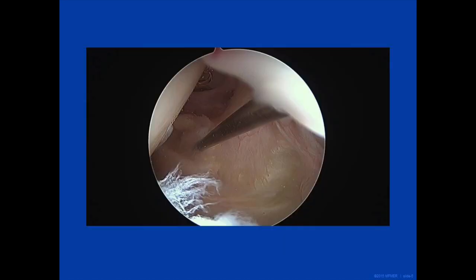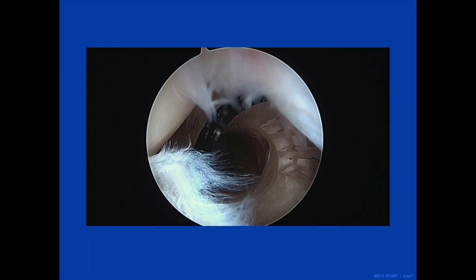Starting with the proximal and posterior portal, an 18-gauge spinal needle is inserted under direct visualization with the scope from the anterior lateral portal. An 11 blade knife was used to make stab incisions at these locations, penetrating the capsule, and a snap was inserted and used to spread the soft tissue. Then, a twisting cannula is inserted to maintain access of the joint.